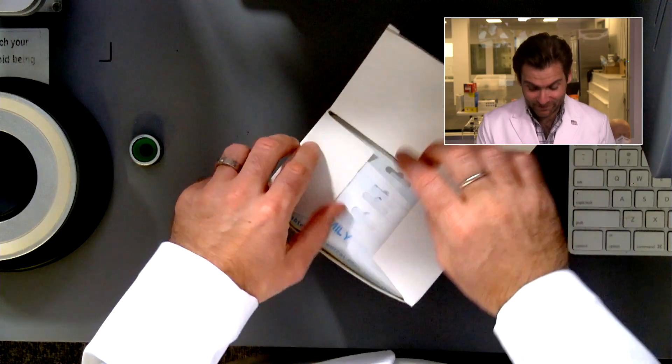Hey everyone, welcome back to the place where we're testing every single mask on Amazon, including — paging Dr. Family, Dr. Family, we have your masks. We need to test them. Let's put these masks in the clamper and see what happens.